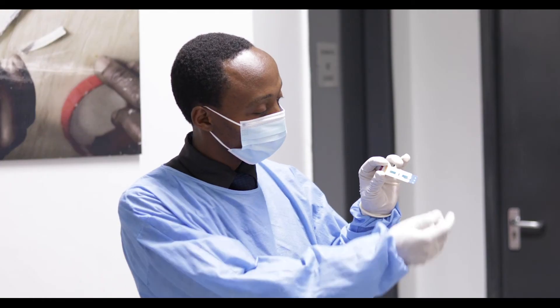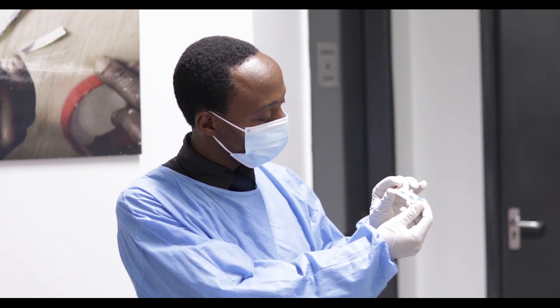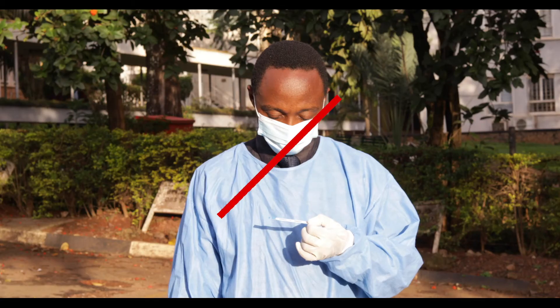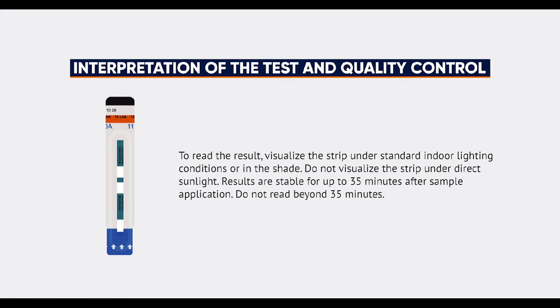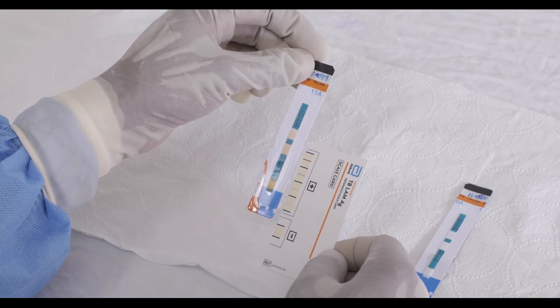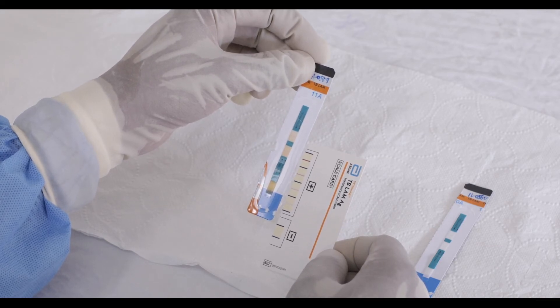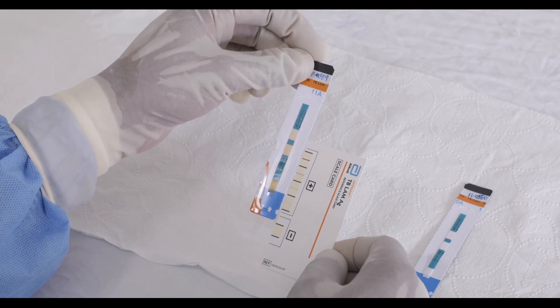After 25 minutes of incubation, your results are ready to be interpreted. To read the result, visualize the strip under standard indoor lighting conditions or in the shade. Do not visualize the strip under direct sunlight. Results are stable for up to 35 minutes after sample application — do not read beyond 35 minutes. Use the reference scale card provided in the kit to assist with results reading and interpretation by holding it alongside the patient window.